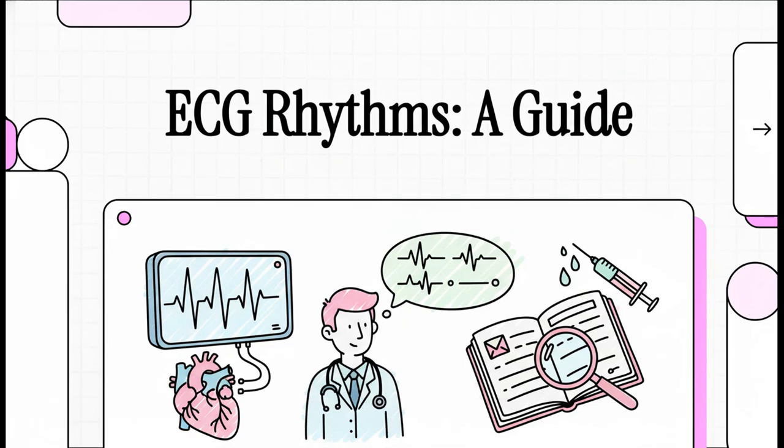If you're an anesthesia student, you know that ECG line on the monitor is way more than just a squiggly line. It's the real-time story of your patient's heart, and that story can change in a heartbeat, literally. So today, we're going to break down the most critical ECG rhythms, pulling some amazing insights straight from Dr. Farhad's notes. Let's jump right in.